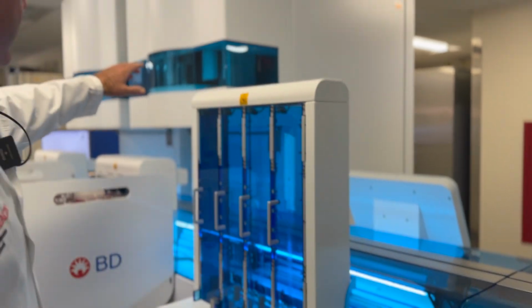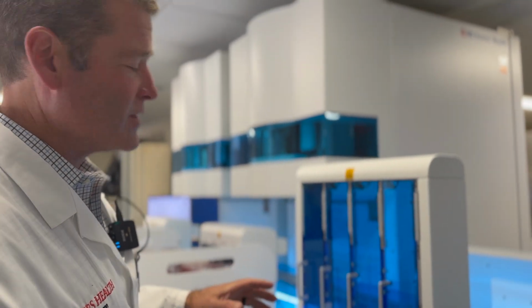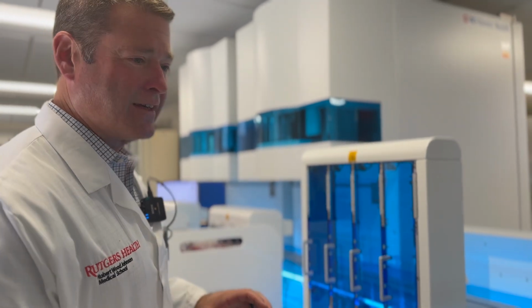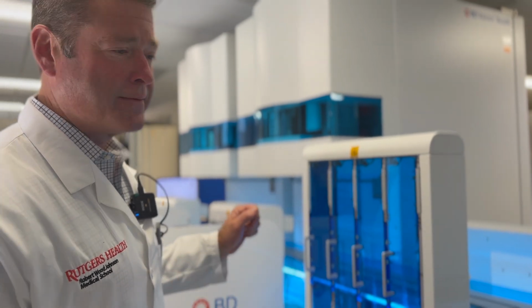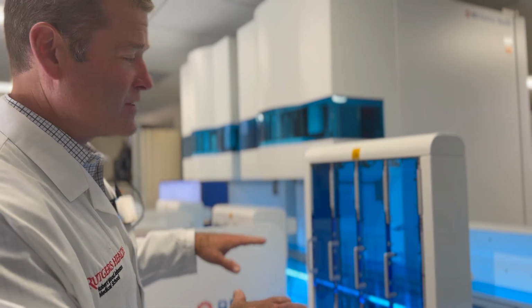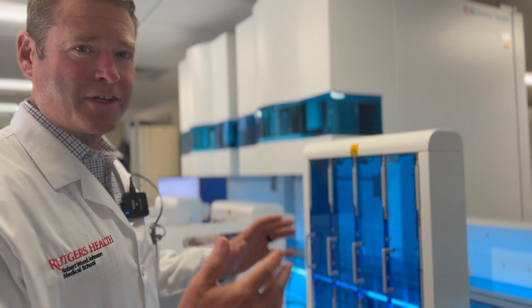And then they'll come up to the top of the instrument here where each of the plates is imaged with a high definition image, both with incident light and backlit, so that the techs can evaluate the plates electronically at their digital workstations. Once the plates are imaged, they go back into the incubator. One of the advantages of a system like this is that the plates never come out of the incubator. They're constantly incubating, so things grow faster. Over here, we'll take a look at what the plates look like on the screen.